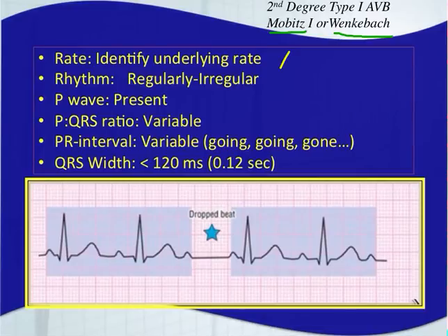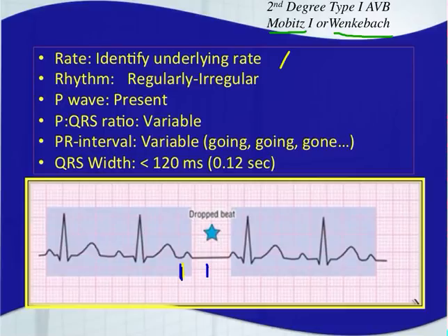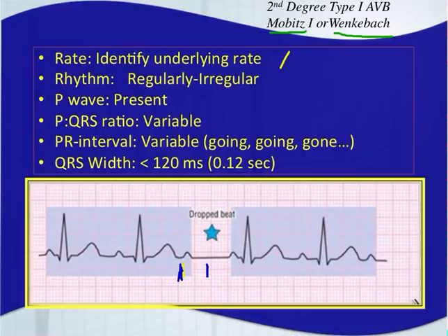Your P wave is present. Your P-to-QRS ratio is variable — you have P waves that don't conduct QRS complexes; there is a dropped beat. You have a P wave but no QRS complex. The other rhythms we talked about that had dropped QRS complexes, such as sinus arrest or sinus block, didn't have P waves present — they had a flat isoelectric line. Here we do have a P wave present, making this different. There's a block between the atria and ventricles where the atria depolarized but the ventricles did not follow.